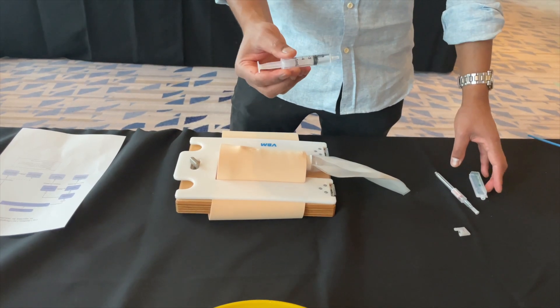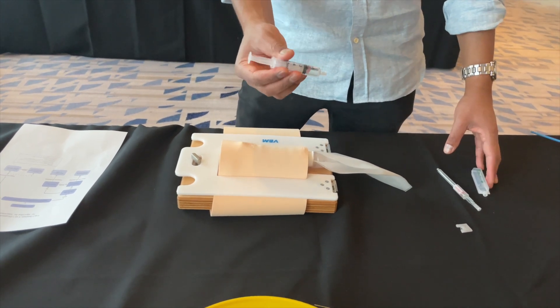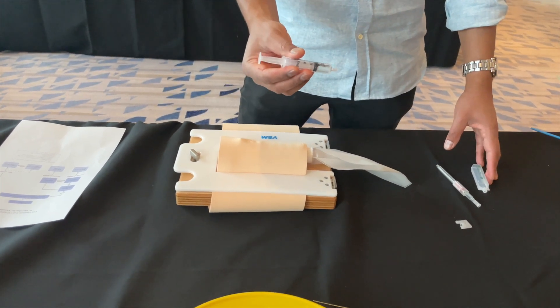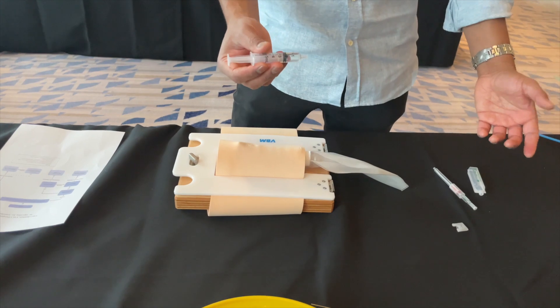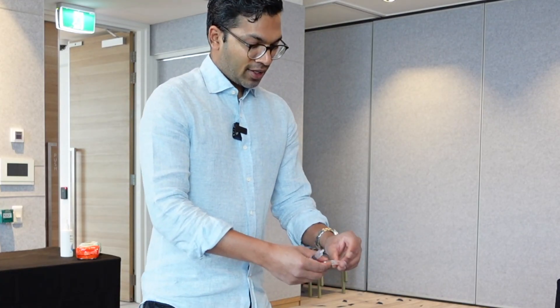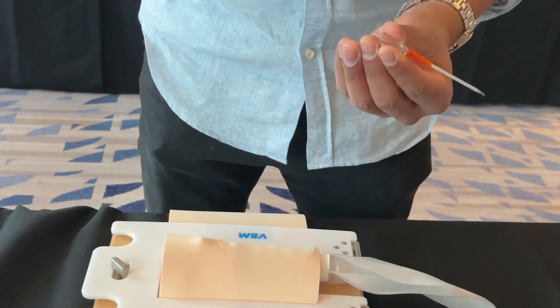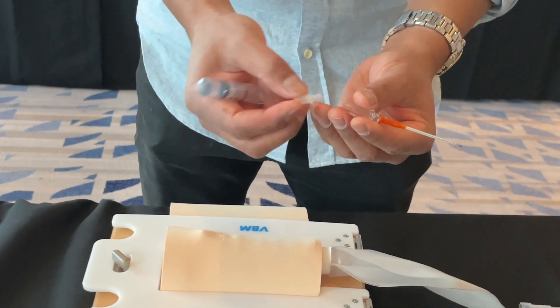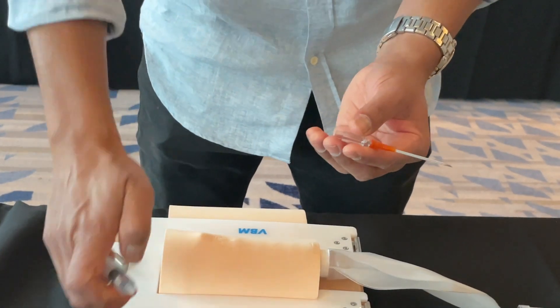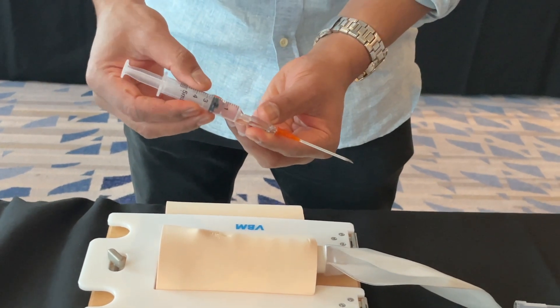You want a 5ml syringe because it's the right size to hold — a 2ml syringe is too small, a 10ml syringe is probably a bit too bulky. Next thing I do is get my 14-gauge needle, take the top off. You really need one of these cannulas where you can take the top off, and I load that syringe on there.